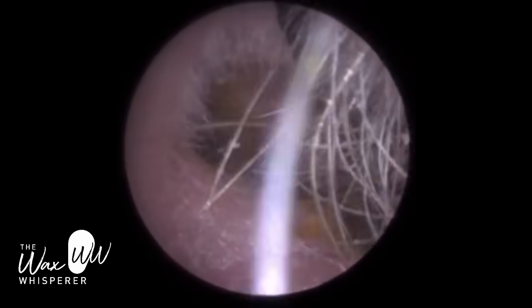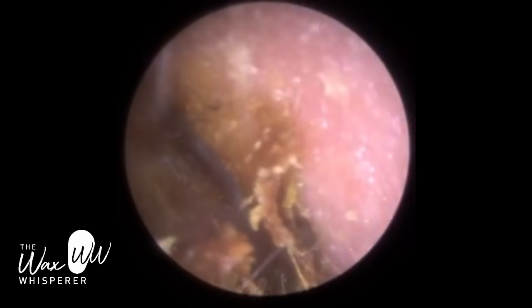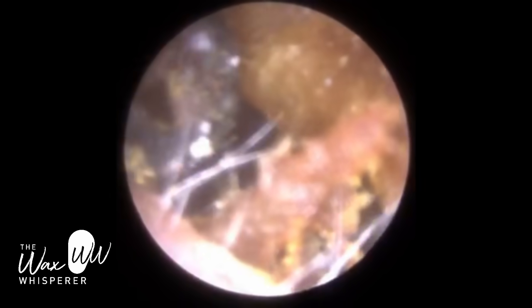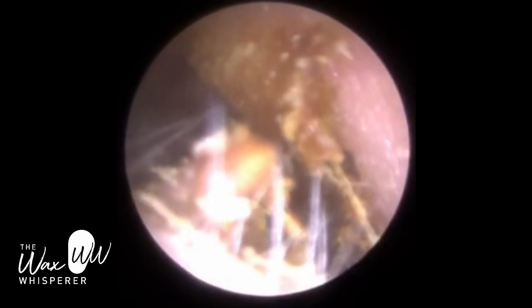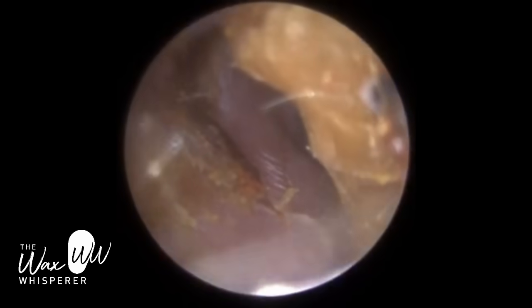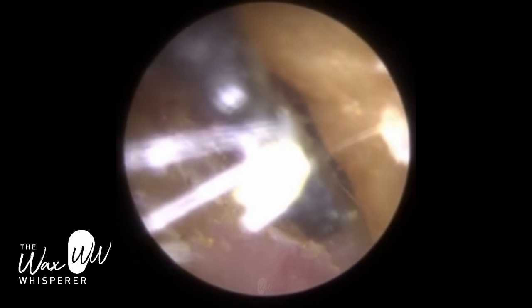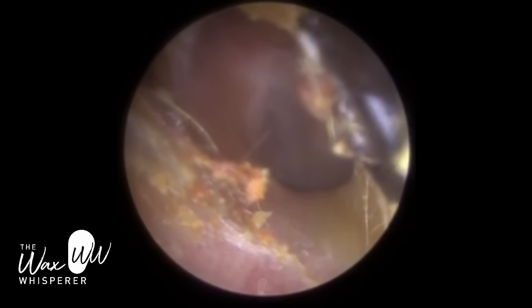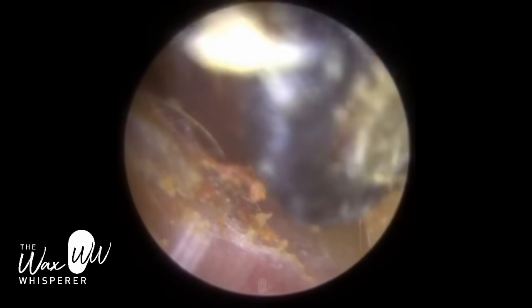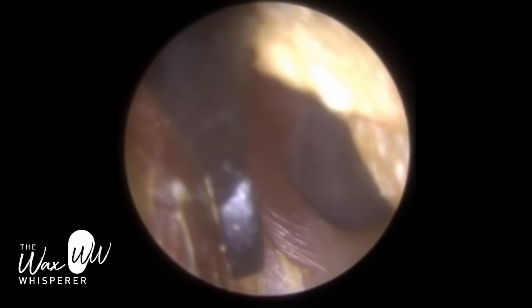Just on the right side now. The right ear is a completely different consistency of wax - very dry, crumbly. The patient hadn't been using any drops on this side, very reluctant to put drops in both ears. Because when you put ear drops to soften earwax, it can exacerbate your symptoms prior to having it removed. That's because the wax absorbs the drops, it swells and expands, and it creates more of a blockage in the interim period in the short term.